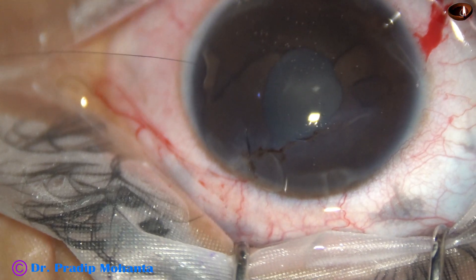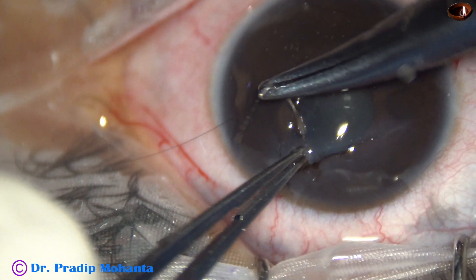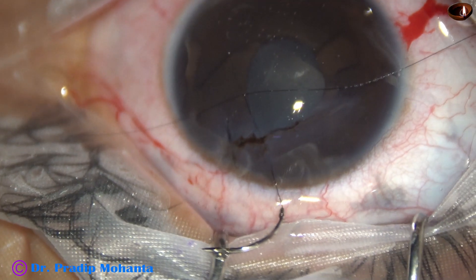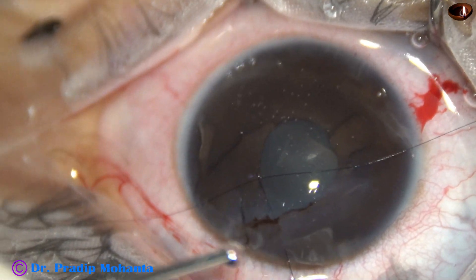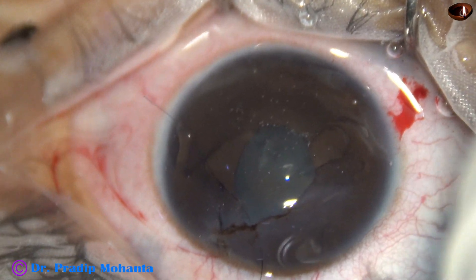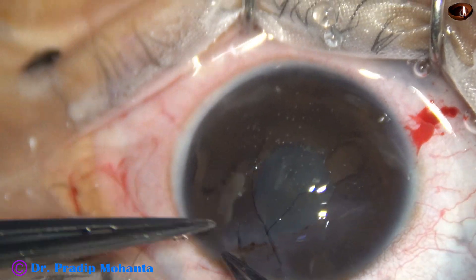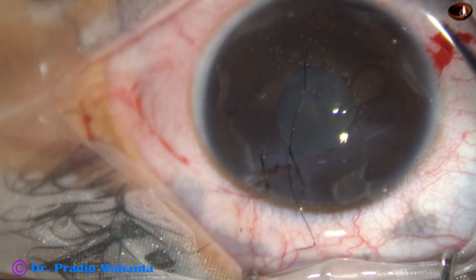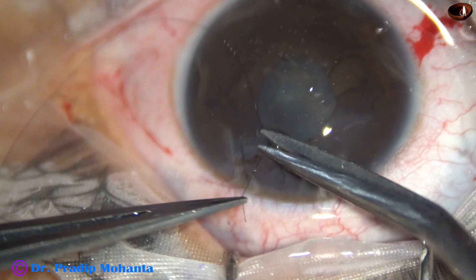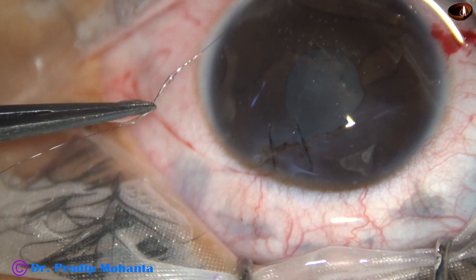Now this is going to be the second suture. I am placing it widely so that another suture will come in between. Again, I use visco to push the iris back, then three loops, then one and then one more — so this is again a three-one-one suture. Threads are cut close to the knot and the knot is buried in the corneal stroma.